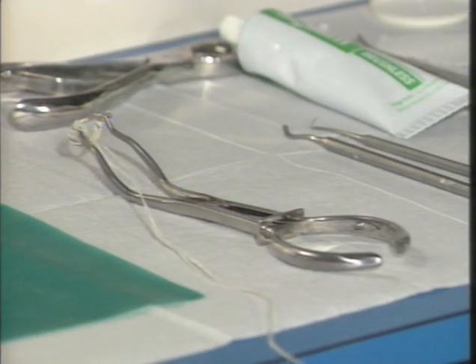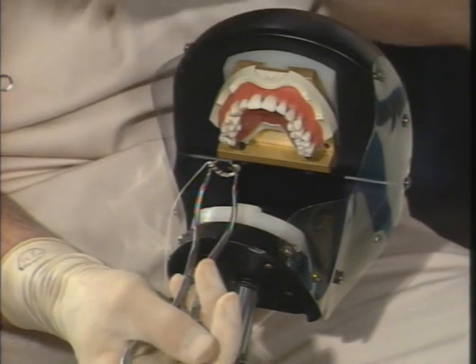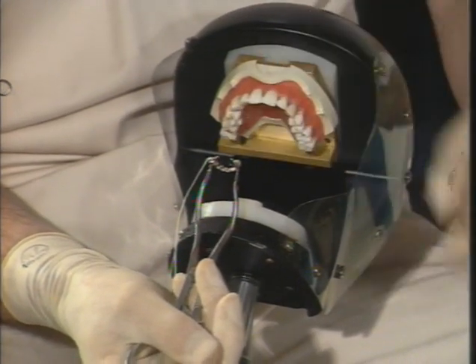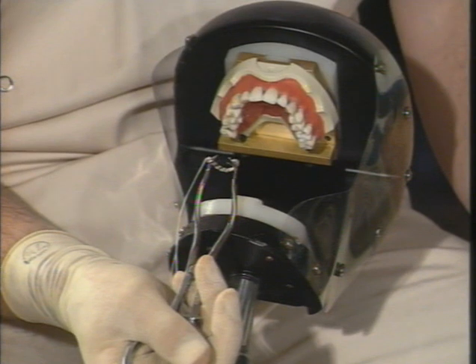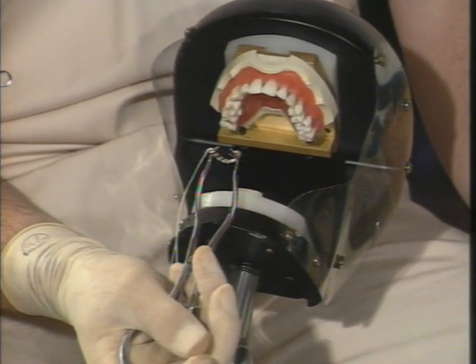The clamp has already been placed on the forceps in the fixed position, and you can see that Chris has already placed the floss around the bow of the clamp. This is just in case the clamp should dislodge during any of these procedures, or in case it should fragment, and then we have control over the fragments.